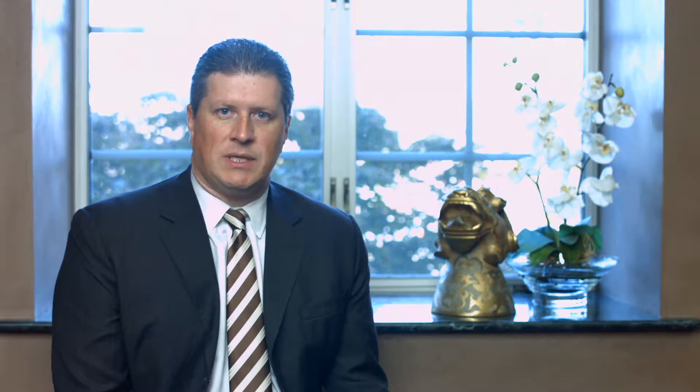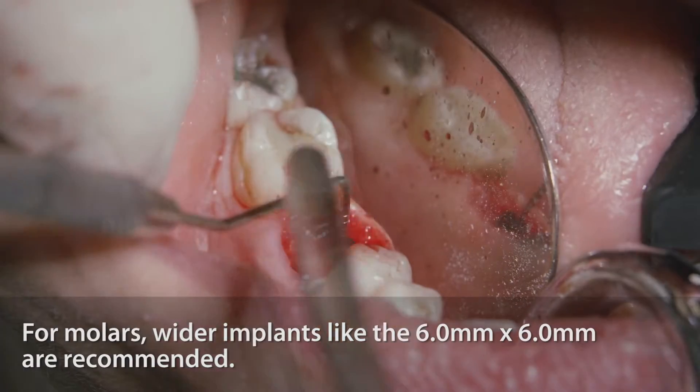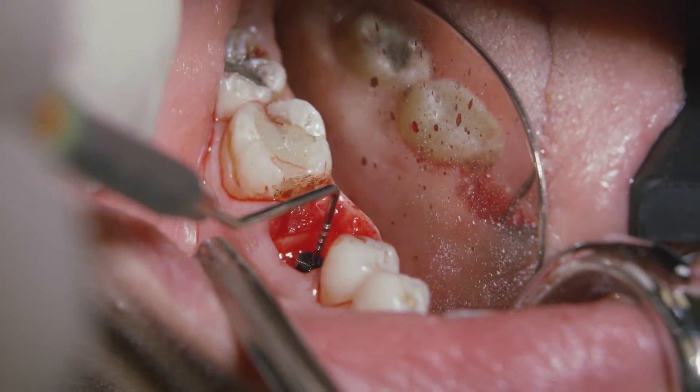Once we finish the osteotomy preparation, we recommend placing a wider implant — usually a 6x6 is the recommended one — in order to try to fill the socket as much as we can. These sockets are usually very wide, and even though we're using a wide implant, we will not be able to fill the entire socket.